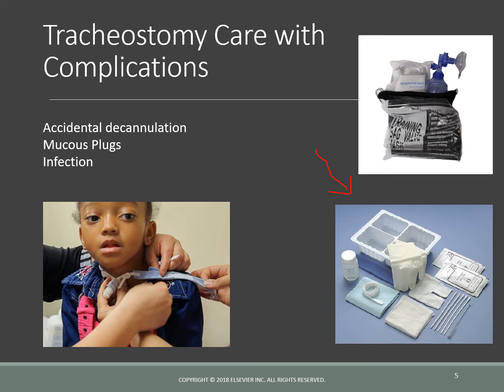You are going to change the trach ties when they are soiled — apply the new ones first, then take off the old ones. Notice here that there are actually two people doing this, because one person is holding and supporting the trach. There is nothing worse than having one tie undone while you're switching, and then the patient coughs. Without counter pressure from a helper, that trach is going to fly across the bed. So make sure you apply the new ones, and after it's secure, take the old ones off from underneath.